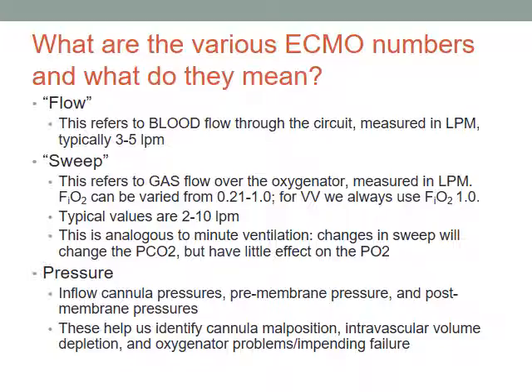Dell still uses that for their program. So that technology is still out there. If you read about it, you wonder, well, why don't we have that? We have good reasons not to have it. Ours is exclusively centrifugal. And the other big piece of equipment is the oxygenator.